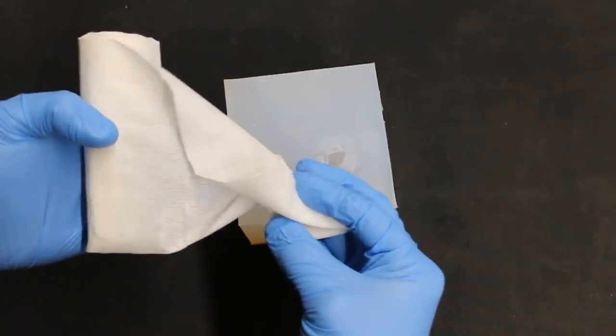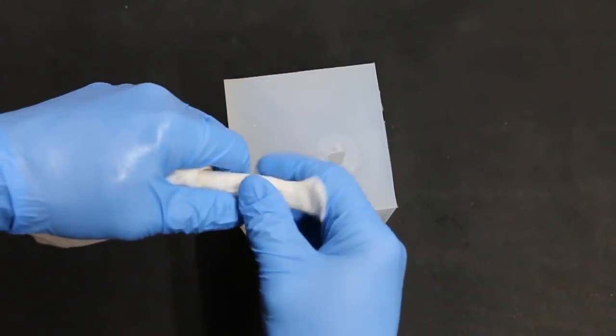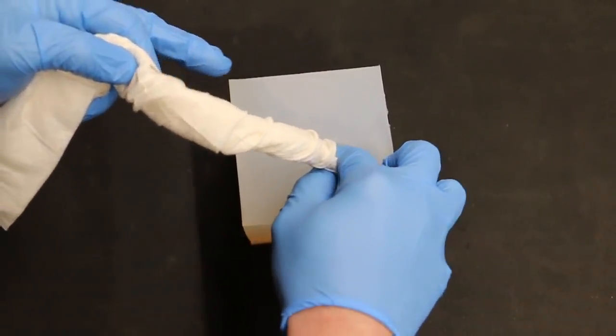When you're wound packing, you can unroll it just like I showed previously. You could also pull it from the center and wound pack like this, so now you have a much bigger bulk to go down into the wound with.